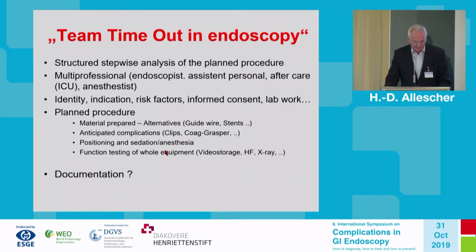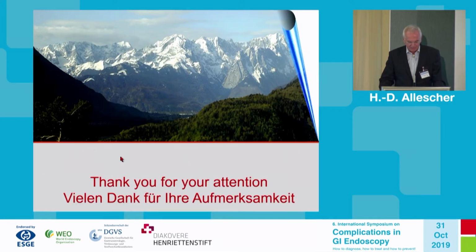What are the anticipated complications, and is the equipment which can handle them prepared? And then there should be adequate positioning and sedation for the patient for this procedure, and there should also be function testing of the whole equipment. And this should be done immediately before the procedure, and all the studies, at least from our surgical colleagues, show that this team timeout will actually reduce the stress during the procedure and will also reduce the complication rate.